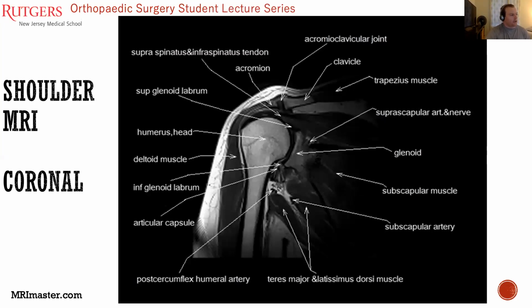So next, moving on to the MRI of the shoulder. I know this is a busy slide, but I wanted to bring it up, particularly to bring up the citation, the MRI Master. This is a website I came across while I was putting this presentation together, and it's pretty interesting. It presents the coronal image of this MRI, and you can scan through, as you would on a normal MRI, anterior to posterior in the coronal image, and it still continues to label each structure that you see in the slide. It's really helpful in terms of tracking where tendons, muscles, and bones are going.